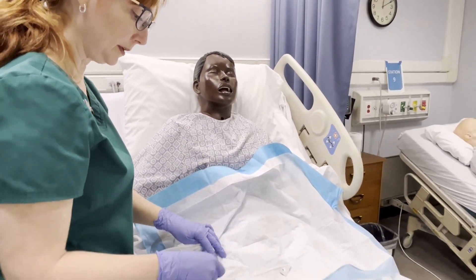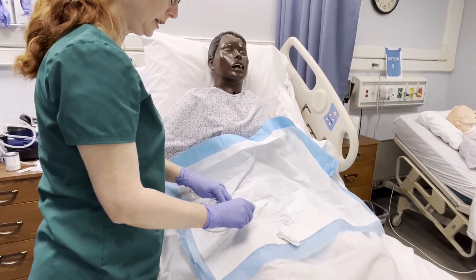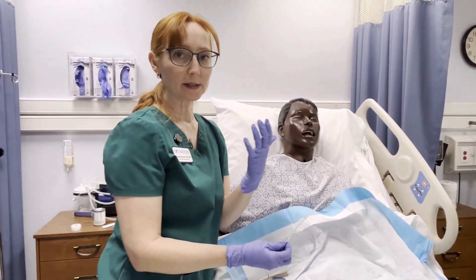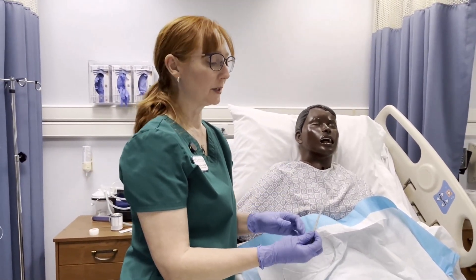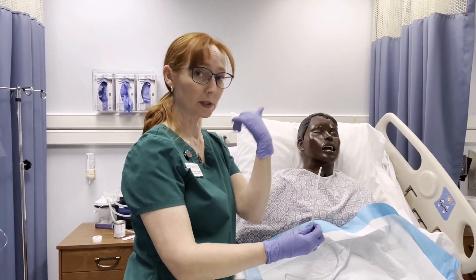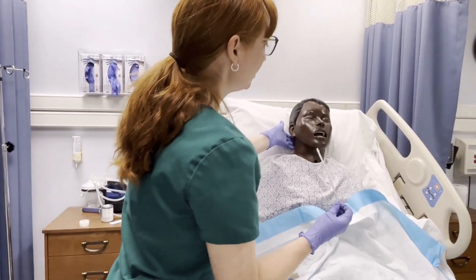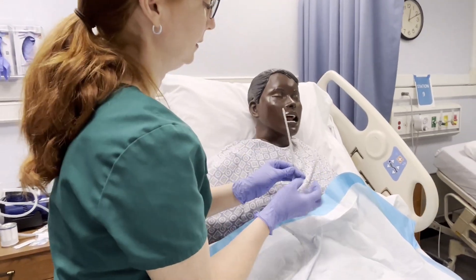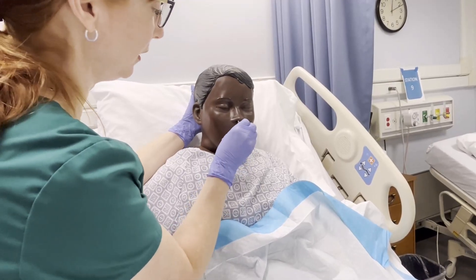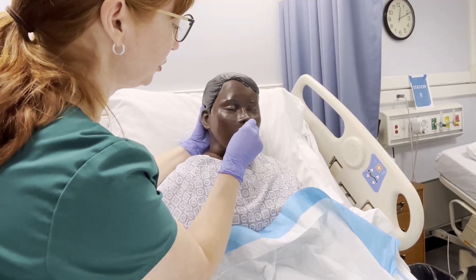I'm just going to lube up the tube. Generally your patient is NPO, but during this process it helps if they're able to swallow. We want the epiglottis to close so the tube goes into the esophagus, not down the trachea. The patient will tip their head forward, and then we're just going to insert the tube. You've got to be kind of quick with it, and then they are swallowing as the tube goes down.